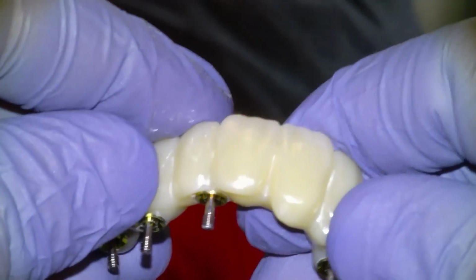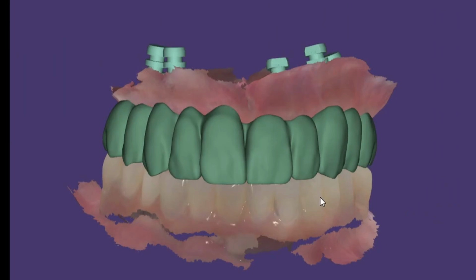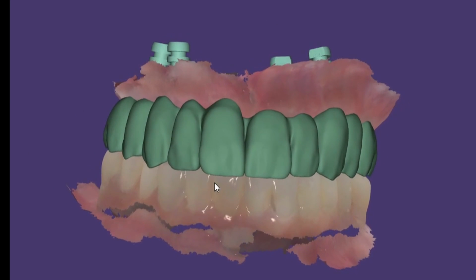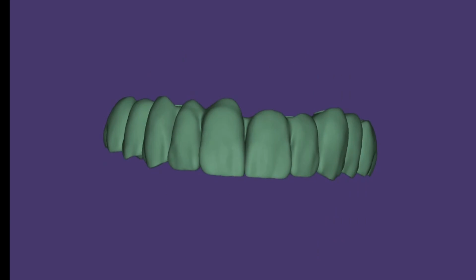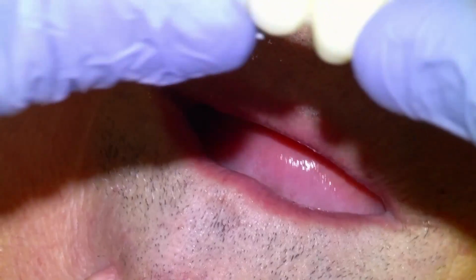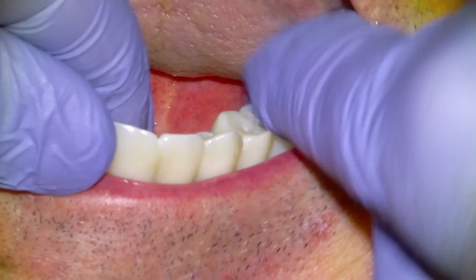There's the implant bridge, and then here is a web view of the CAD software showing the design. I don't design these things, I just manufacture them, but we were pretty happy. We got away with a pretty slick design for this one. The sleeker you can make it, the more natural it will feel, and the easier the speech and function. I was quite happy with the design of this implant bridge. You didn't even need to have gum tissue on it, so something like this is going to feel very natural in the mouth.